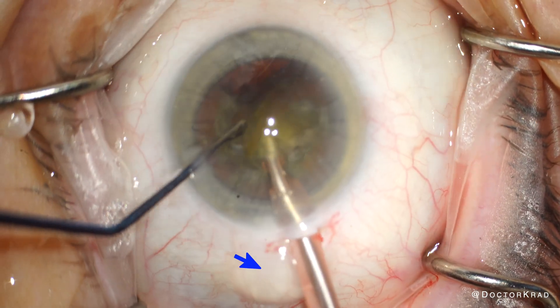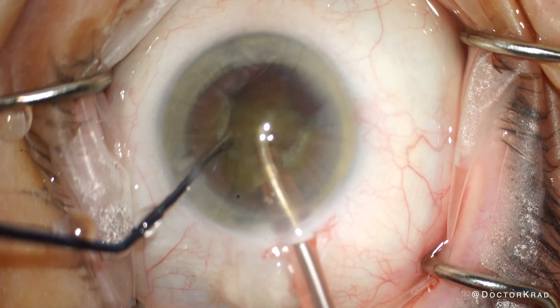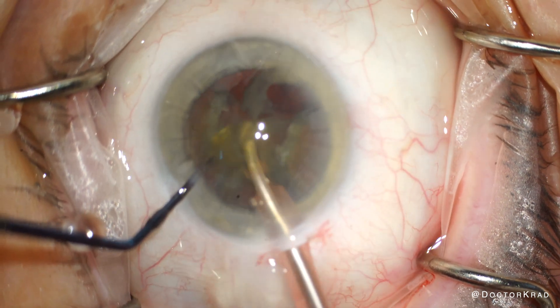Here I'm noticing some chemosis on the left side. I'm going to address it in a second, and I'll let you know how to prevent it. The only other adjustment to make is to lower your bottle height a little bit so the eye pressure doesn't build up too much to stress the RK incisions.